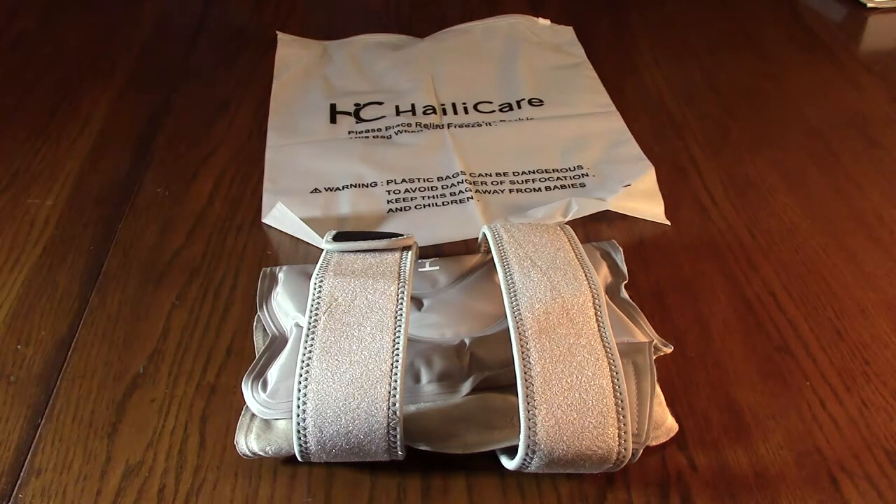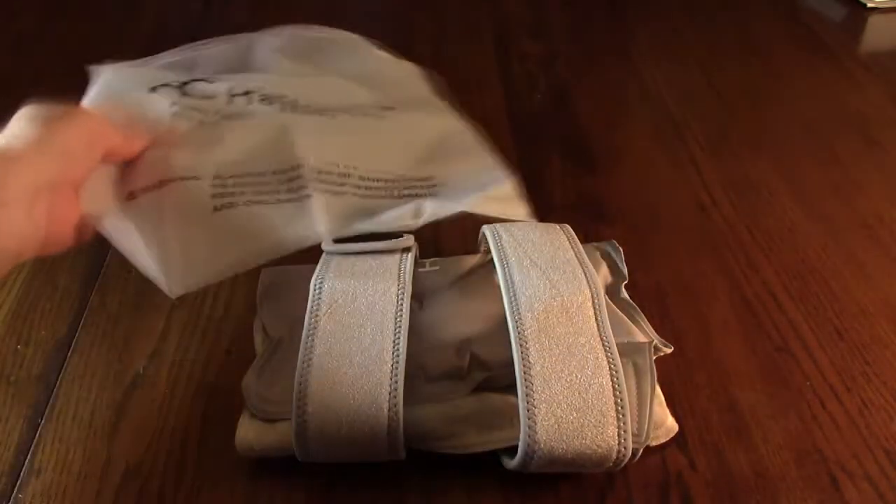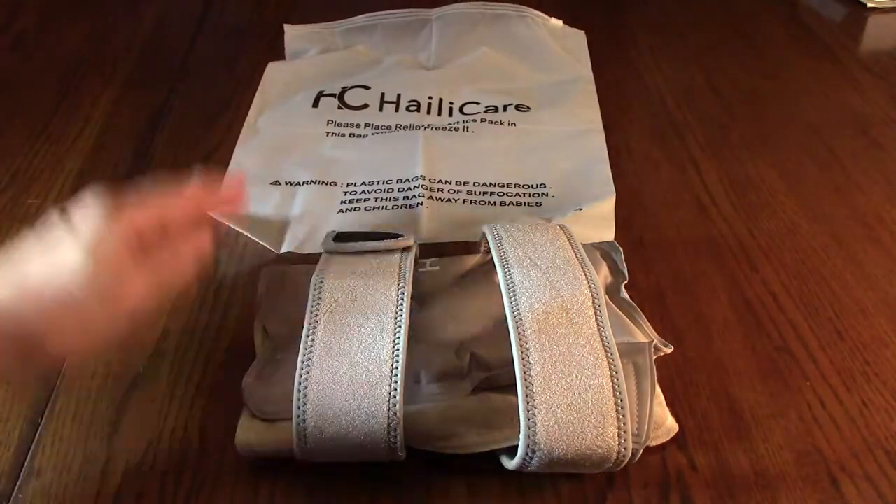Behind the product is a plastic bag, and this allows you to put the whole unit into your refrigerator so you don't have to worry about it touching your groceries.